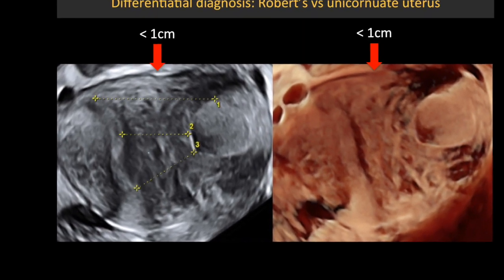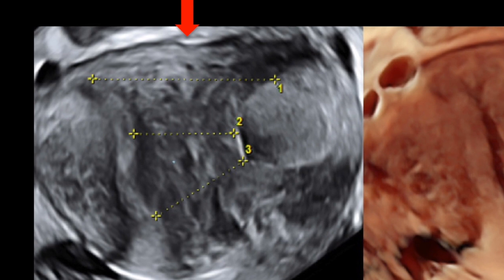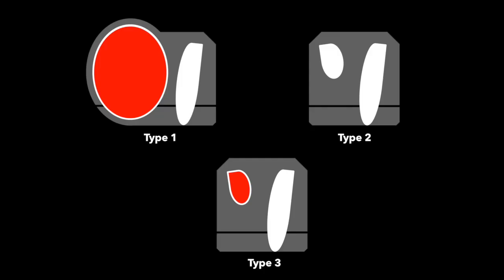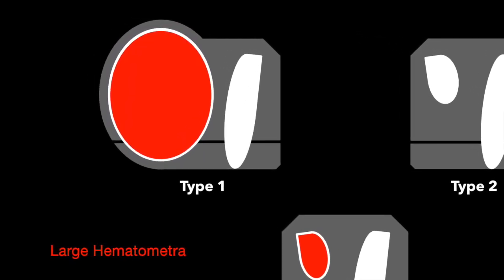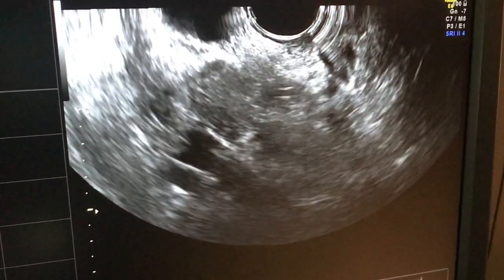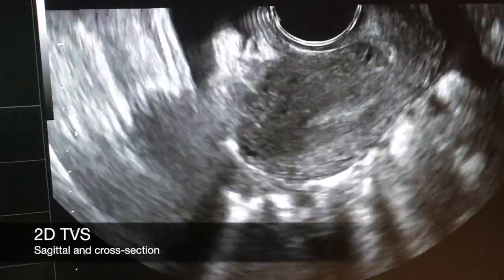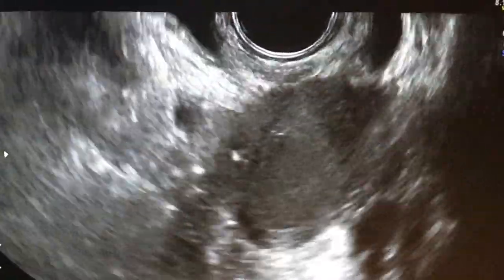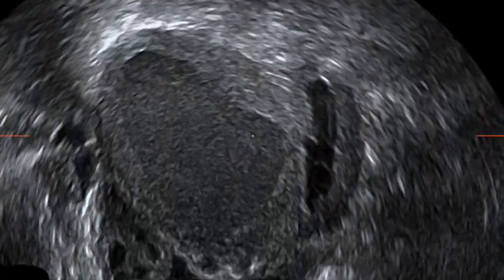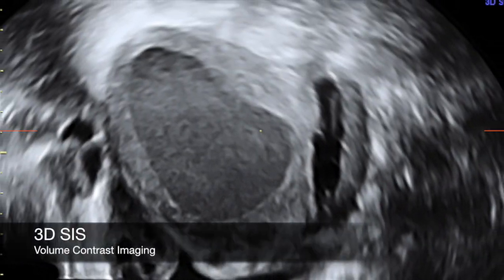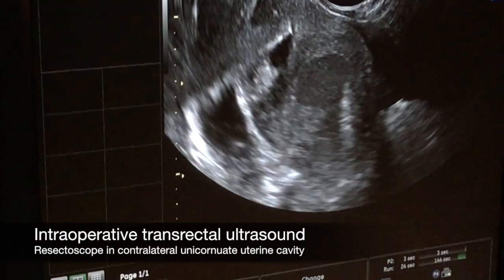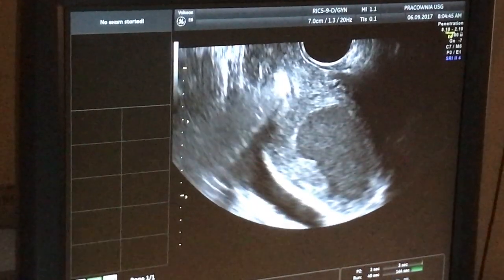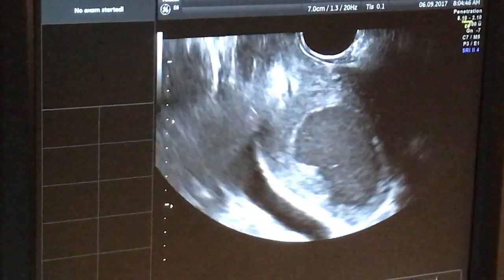The important point in surgical planning is measurement of the distance between the two cavities, indicated by the yellow calipers. Robert's Type 1 uterus with large hematometra usually gives acute symptoms and may require fast-track surgery. Using 2D ultrasound on the sagittal and transverse sections, one can see a large fluid space next to the endometrium. 3D sonohysterography with different render modes confirms the diagnosis. The procedure is performed using transrectal ultrasound guidance at the beginning and end of the resection, in contrast to transabdominal ultrasound which tends to produce poor images.